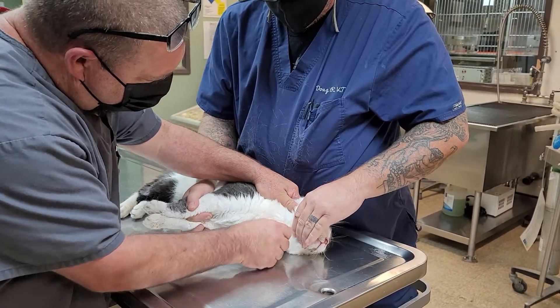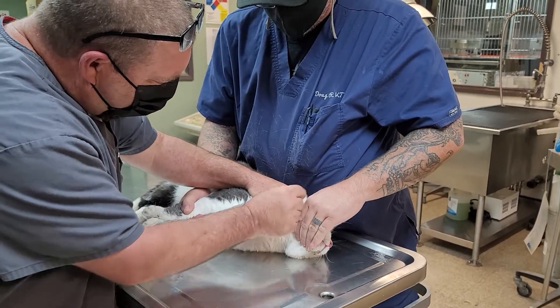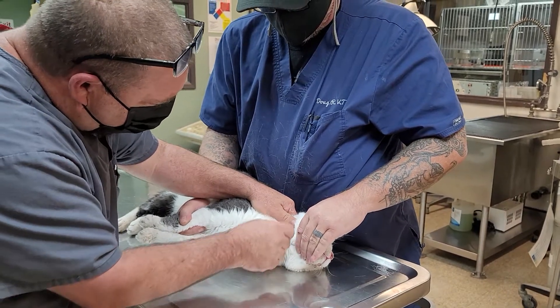Now, he doesn't like the alcohol. Another thing I don't do is squirt cats, because sometimes at home they're reprimanded by squirting, and that could set them off.